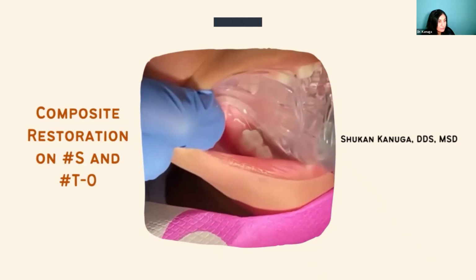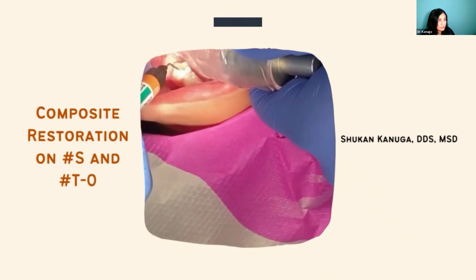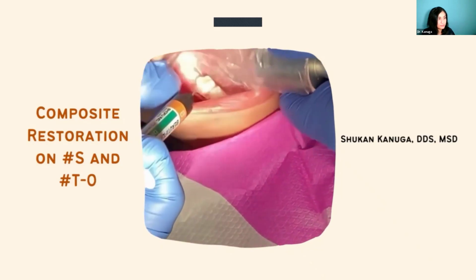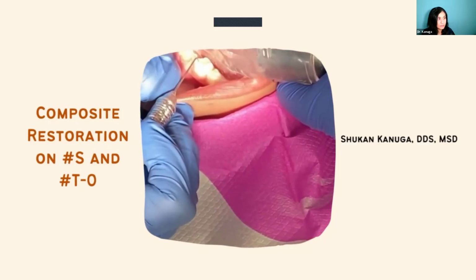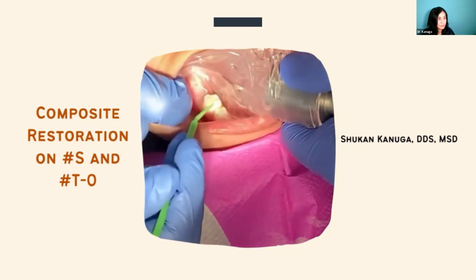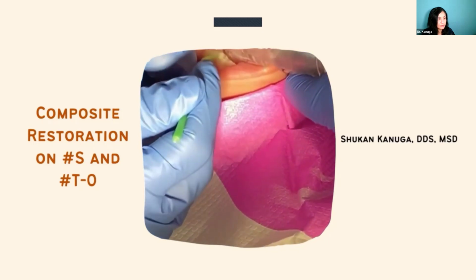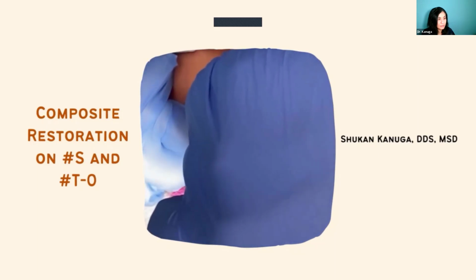Almost done, okay? So we're just putting the paint now, okay? Remember the paint I showed you? The last part, okay? That's what we're just putting on, and then you're all done, okay? Grace, let's try to stay still like a statue now, okay? Put the brush if you can here. So we're gonna put the little line where it's gonna make it shiny, okay? Good job. You're all done, Grace. You're already done, okay?